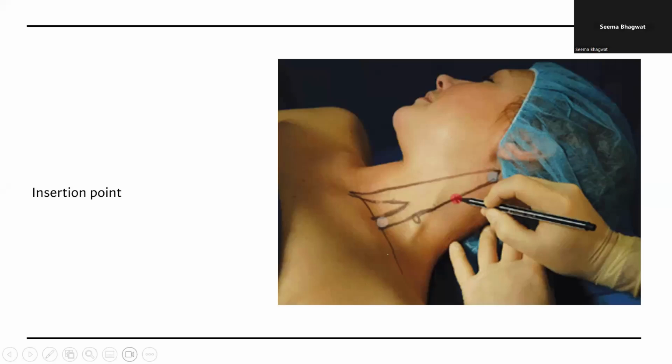Hi, good afternoon, sir. I would like to ask, what is the length of the needle used in the mandibular block? PNS needle, I'm asking. Centimeters, we'll use the long needle.